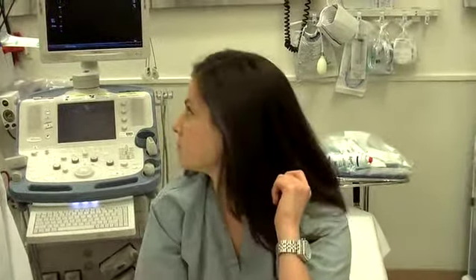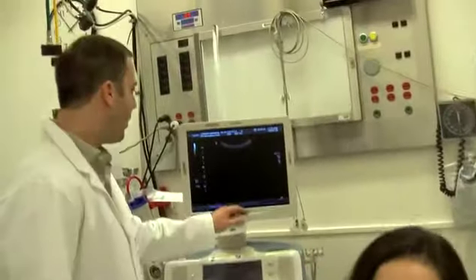What's that? When you talk about the parasternal long view, the one that goes here, sternum, move it over in between the ribs, turn it, there's an error because your book says pointed to the right shoulder, when in fact it should be pointed to the patient's left elbow, unless... Well, actually, it depends on where your indicator is on the screen. That's why we stress that your indicator should always be in the upper left-hand corner of the screen.